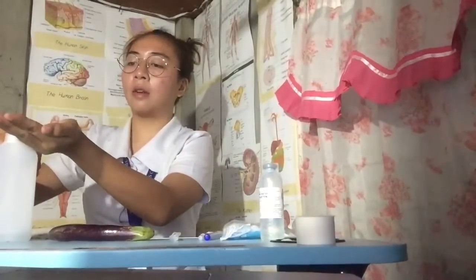Read the label on the medication when it's taken from the medication cart, and again before withdrawing the medication and after the medication. Organize the equipment. And now perform hand hygiene and observe the appropriate infection prevention procedure. So now I have here alcohol, and I'm going to use alcohol on my hands to prevent microorganisms. So provide for the client's privacy.